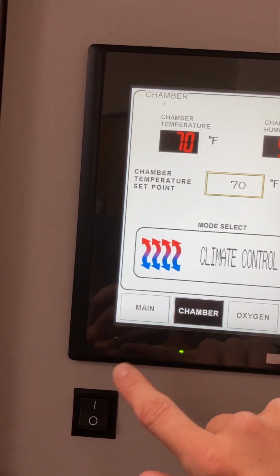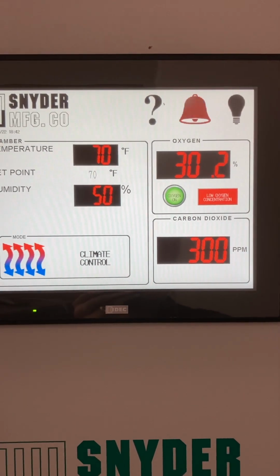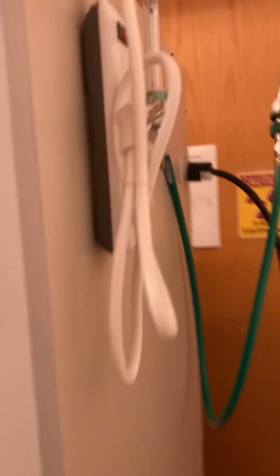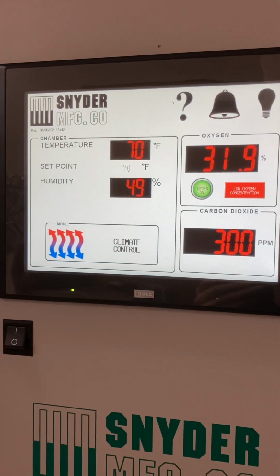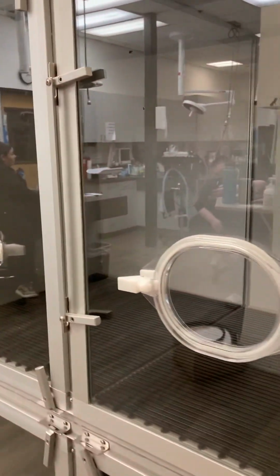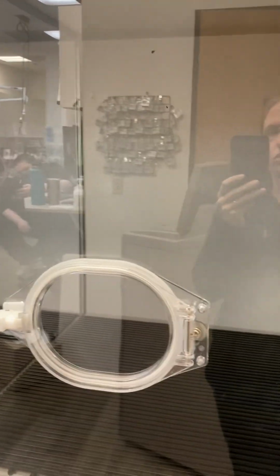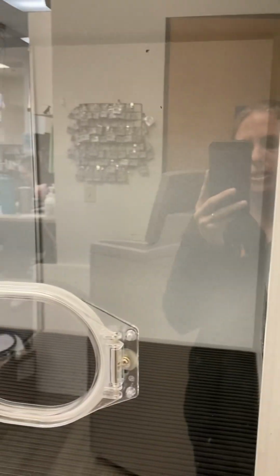So climate control, go back to main, and then now it should take about 8 minutes to reach your 40% concentration, and you'll see that your flow meter now is at 15 liters a minute. Once it reaches concentration, you can go ahead and pop your patient into oxygen cage. It's important to note that if you have a divider in, the patient needs to stay on the right side of the 2 compartments. And that's how you put a patient into oxygen.